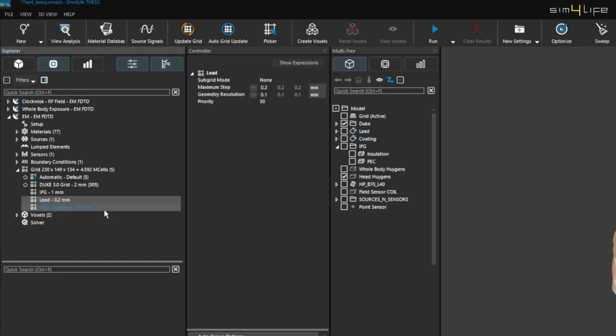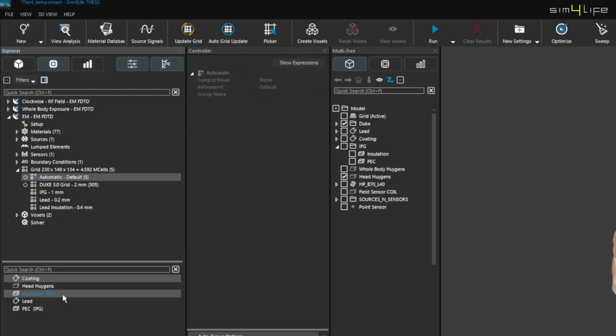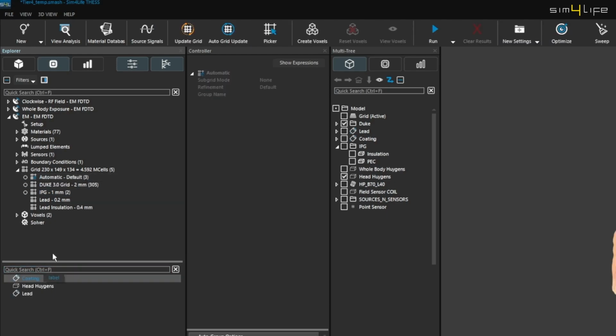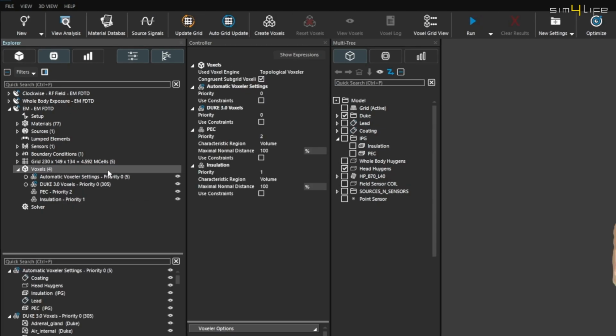For the IPG, we set a maximum grid step of 1 mm in all directions. For the lead, the grid step is set to 0.2 mm. Lastly, for the lead insulation, the grid step is set to 0.4 mm.